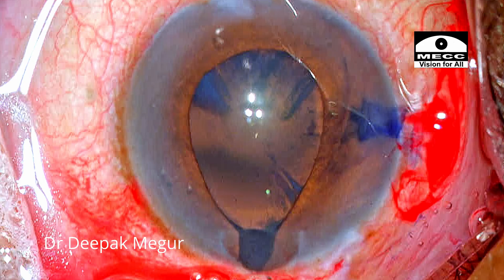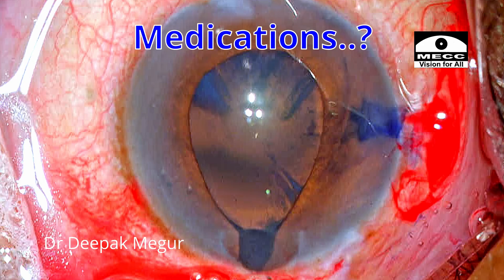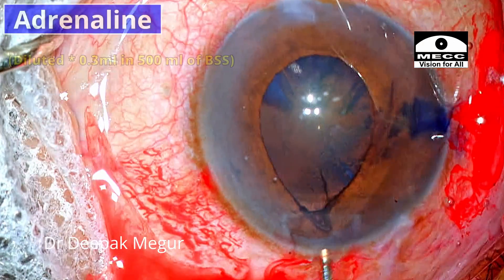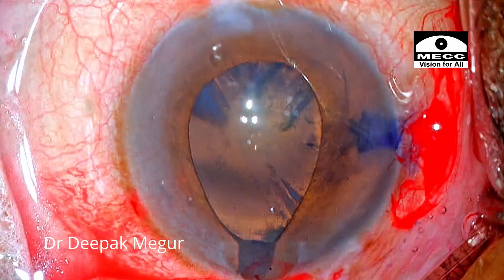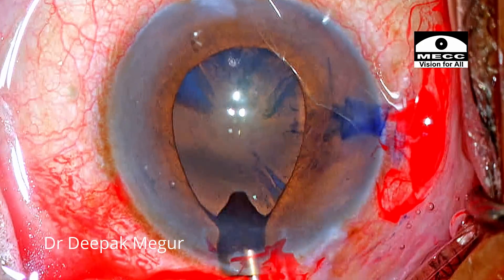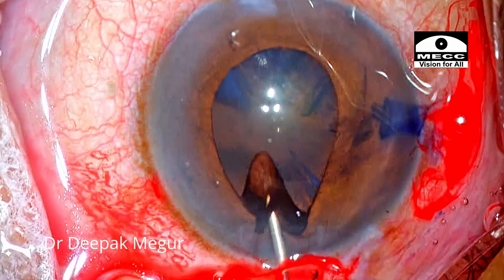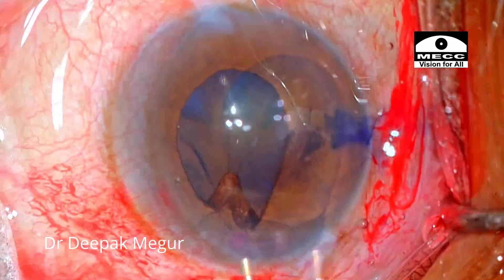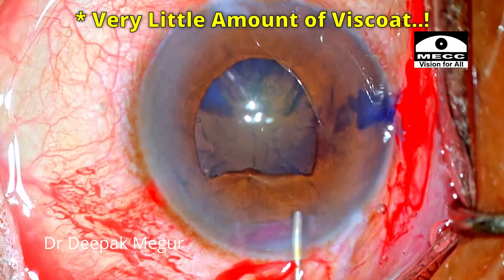I asked him what medications he's taking, and he replied just antihypertensives, nothing else. I use adrenaline hoping the pupil dilates a little and try to repose the iris without putting anything else in. By doing so some of the OVD is let out. Once the eye has become a little soft, I put viscoat in, which pulls the iris back. The iris is now looking a little bit stable.